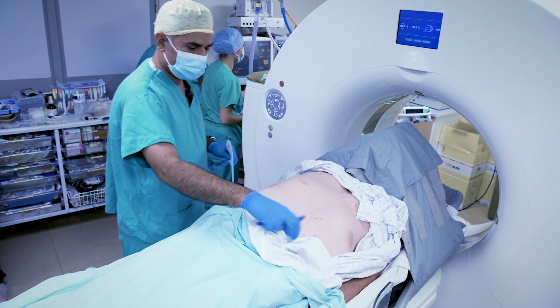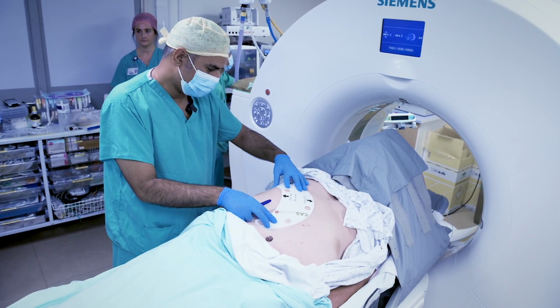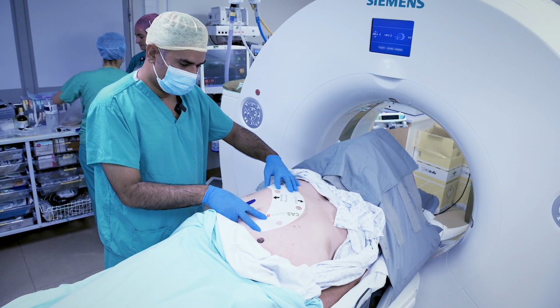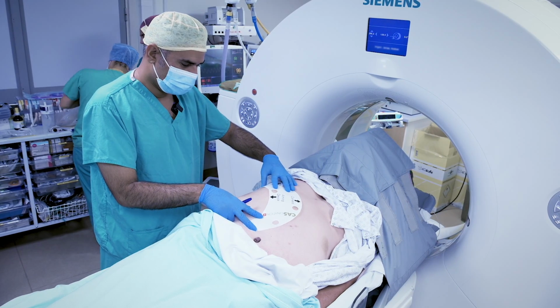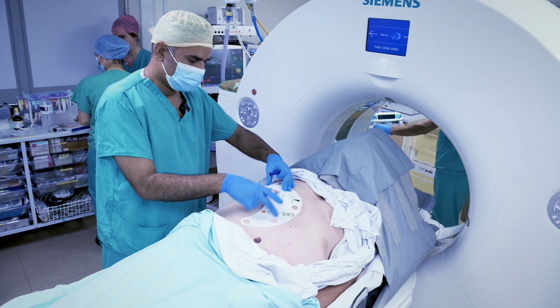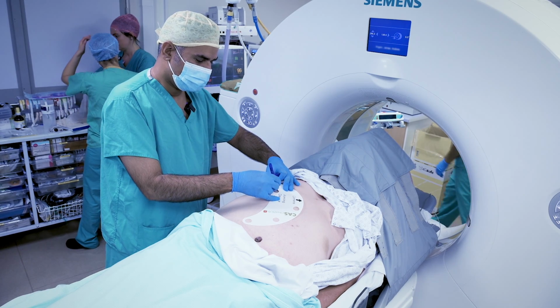And the next thing we're going to do now is just to work out where the stereotactic markers are going to go. So we need these to be in a position where the video camera on the CAS-One device will see them, but they won't interfere with the trajectory of the planned needle. So something like this, slowly rotated around, will be suitable. We use the template aiming device to draw on the patient's skin with a skin marker.